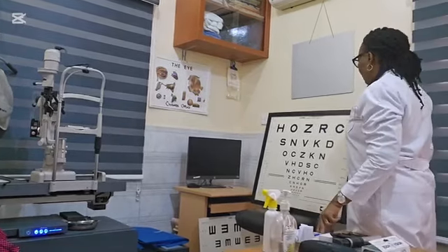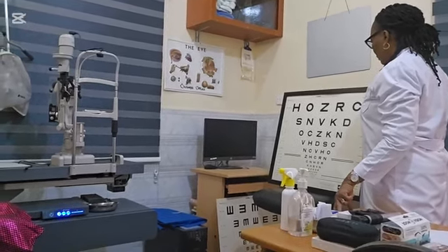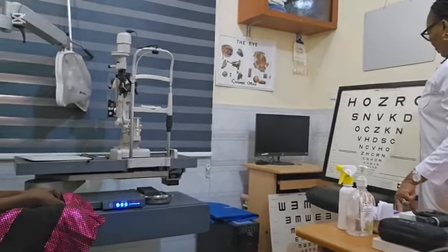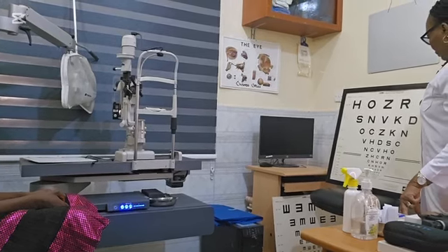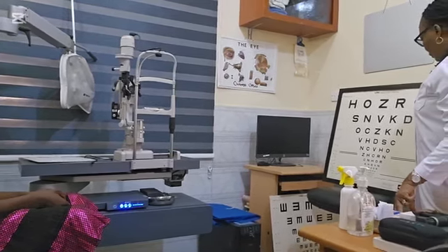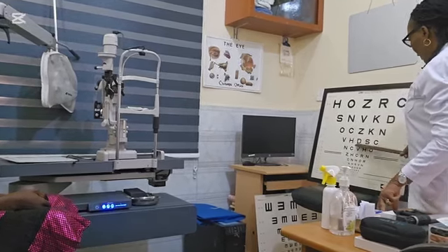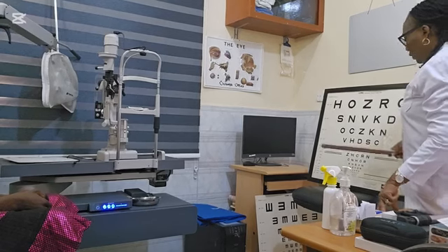HZRC. SNVKO. OCZSN. VNOSOC. What is this? OC. Okay.